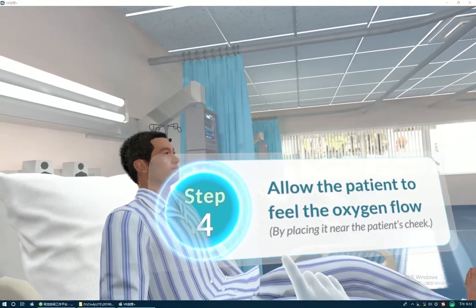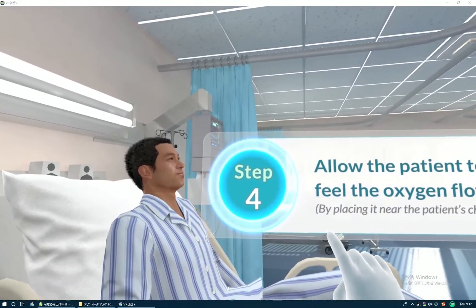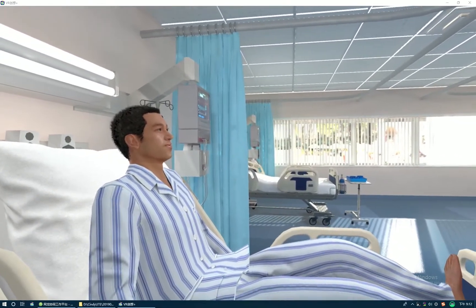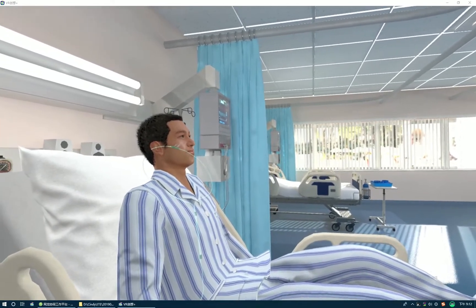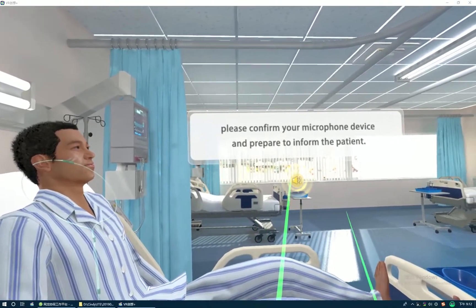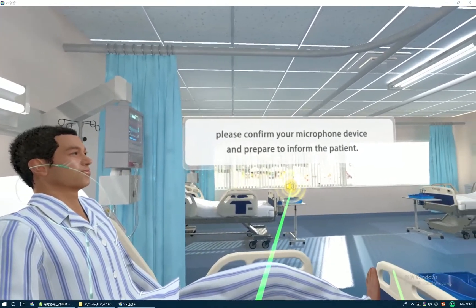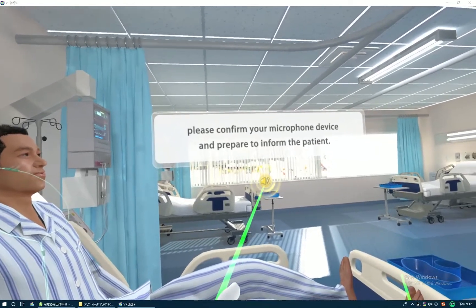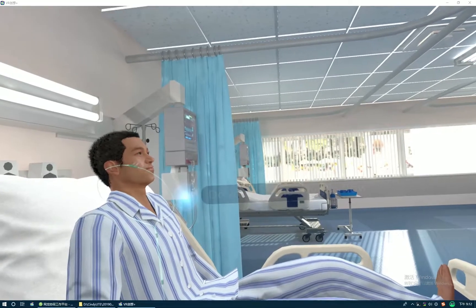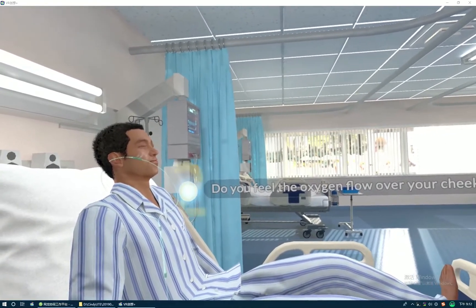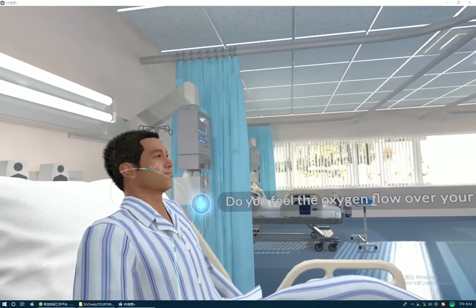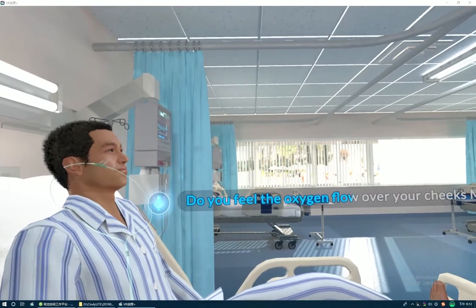Allow the patient to feel the oxygen flow, for example by placing it near the patient's cheek. Please confirm your microphone device and prepare to inform the patient. Ready? Three, two, one, go! Do you feel the oxygen flow over your cheeks, Mr. Lee?